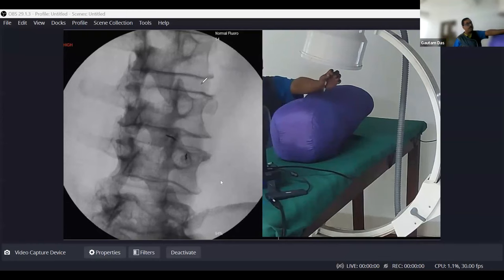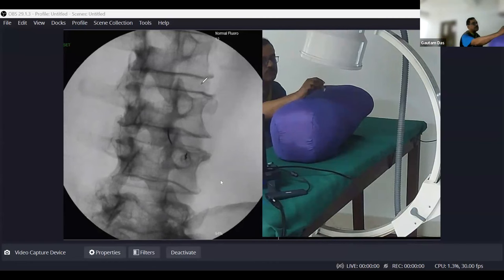So now I am going in again with tunnel vision. My needle is over the joint line. I am not touching the bone. You have to touch the bone there. Now I am inside the joint, though being completely inside the joint is not possible here because it is a mannequin. So I'll be just in the mouth of the joint. At this point, I'll be going lateral.